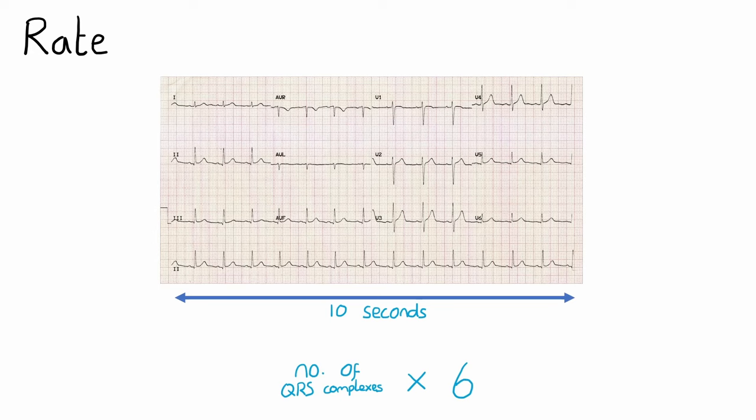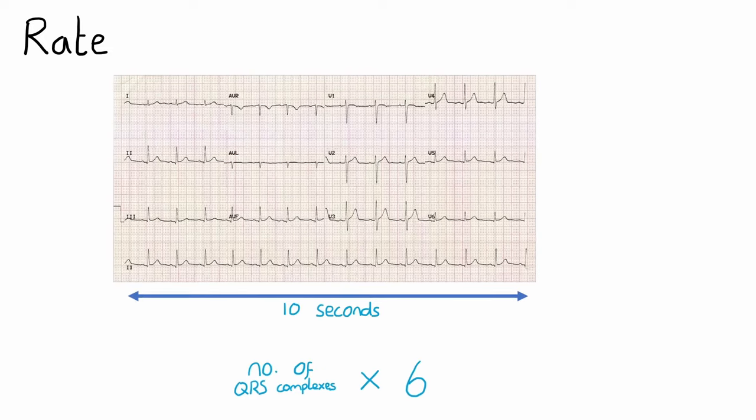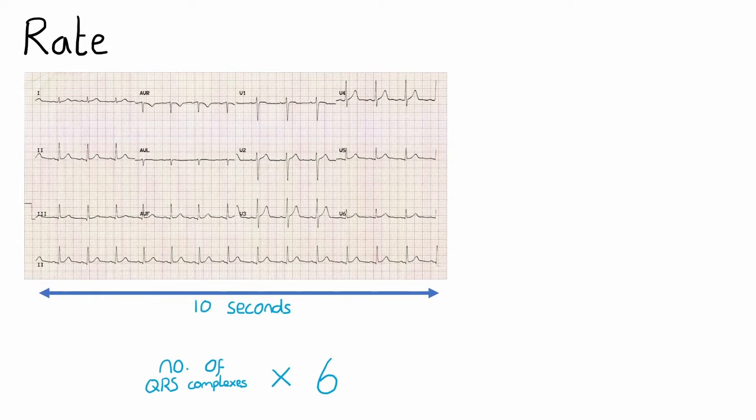Again, feel free to pause the video if you like and take a moment to calculate the heart rate. 14 QRS complexes multiplied by six gives us 84 beats per minute. This particular ECG has a regular rhythm, so you could use either method here.